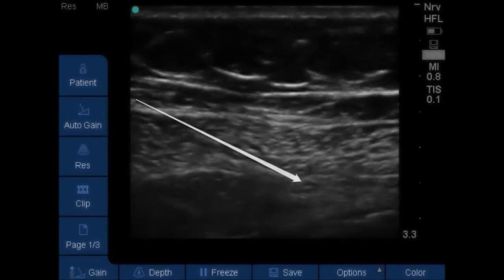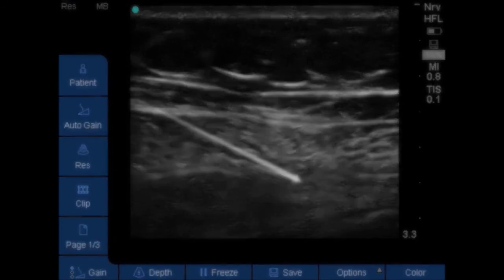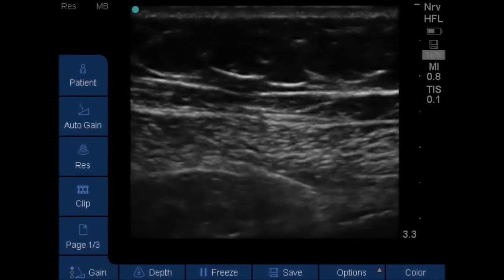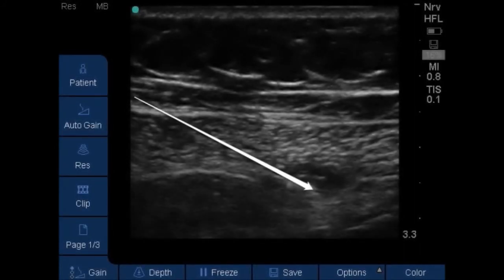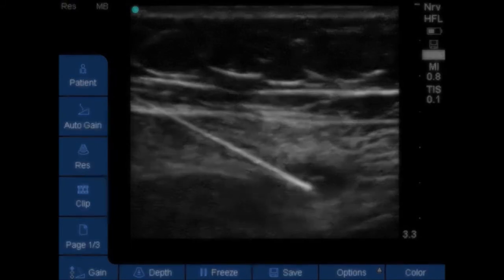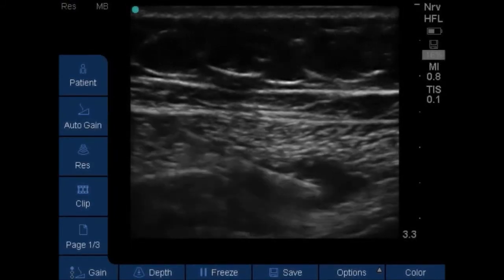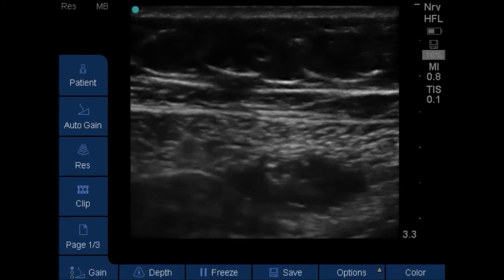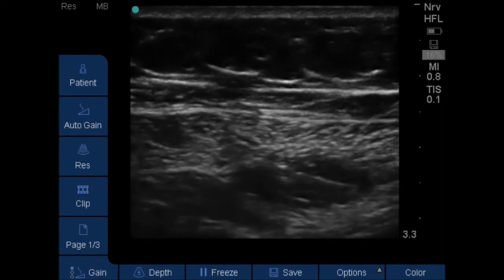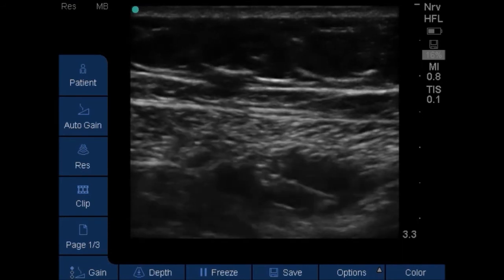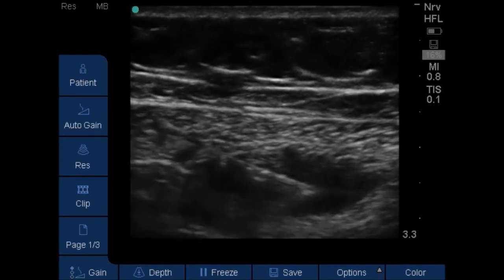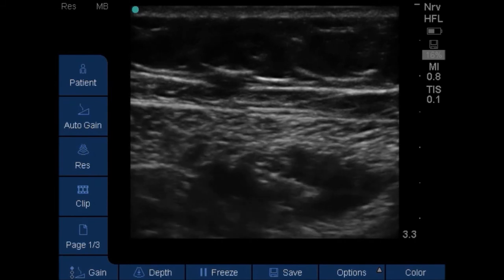Here it can be seen popping through the second fascia. Now a small test injection is made to try and get a fascial spread. Once you get a fascial spread, you try and centralize the needle in the center of this small fascial space that you've created. As you do this, you advance your needle to try and keep it in the center of this local anesthetic spread so that you can get a nice interfascial plane spread and avoid an intramuscular spread.